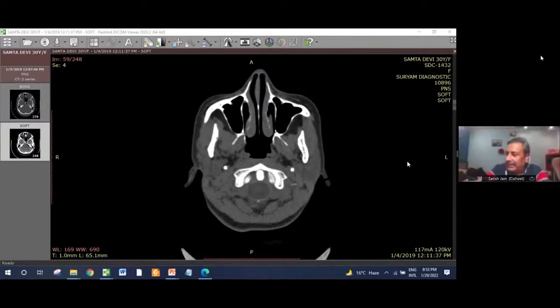Yes. So CT scan, as I mentioned, gives you bony details. Now, as far as mucormycosis is concerned, the CT scan has a limited role, because mucormycosis gives bony infections. It replaces the bone marrow, involves the bone, gives bony necrosis, and all those things are best appreciated on various MRI sequences, wherein the marrow is replaced by the disease. So signal intensity changes in the bone marrow are best picked up on MRI.